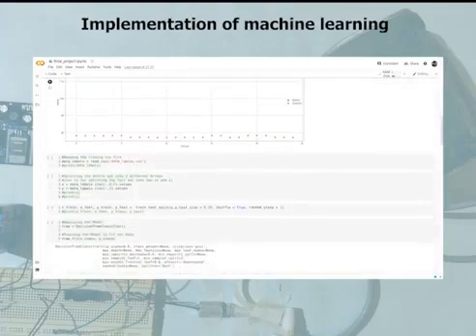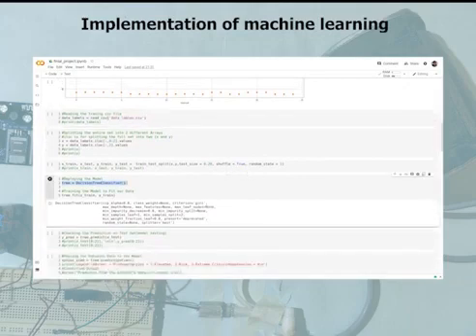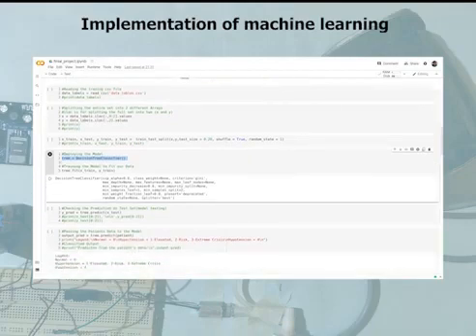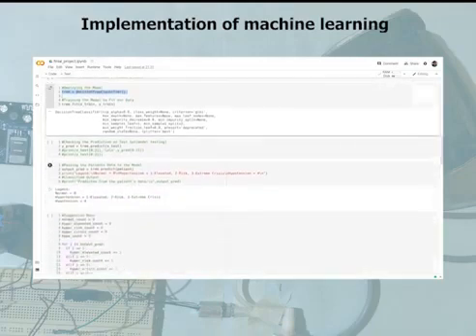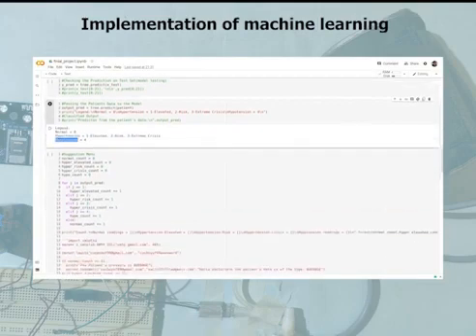In the next set, we load the dataset required to train the model. The model which we have used here is decision tree classifier, and it classifies the patient into different blood pressure diseases. We have used the legends, namely normal is labeled as 0, hypertension has 3 cases in which we have labeled elevated as 1, risk as 2 and crisis as 3. Hypotension is labeled as 4.